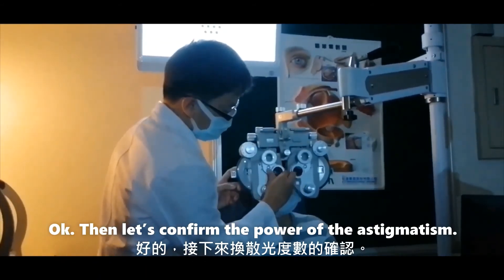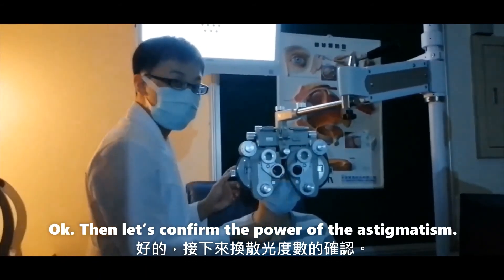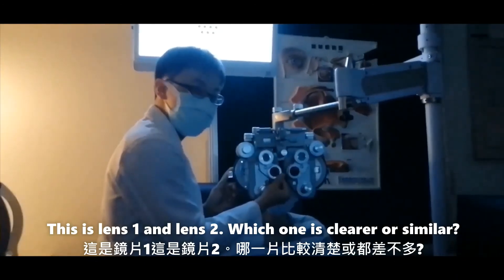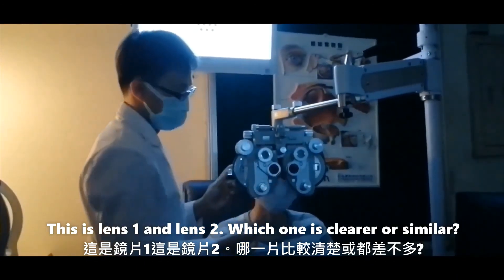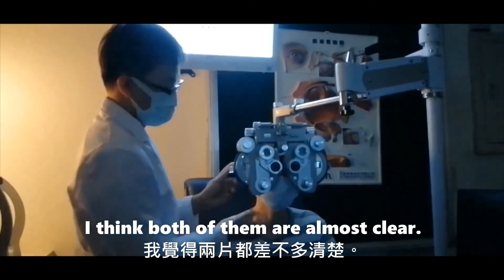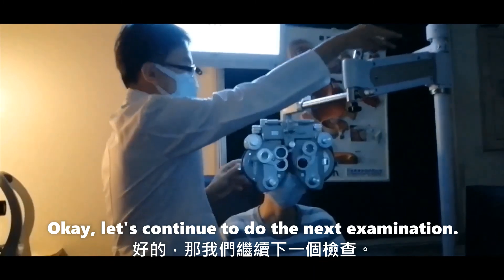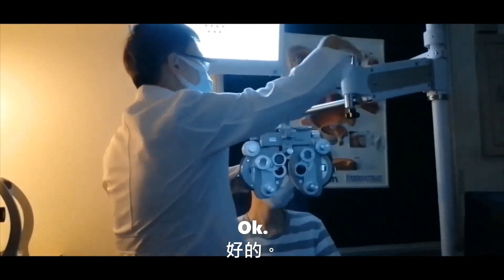Then let's confirm the power of the astigmatism. This is lens 1 and lens 2. Which one is clearer or similar? I think both of them are almost clear. Okay, let's continue to do the next examination. Okay.